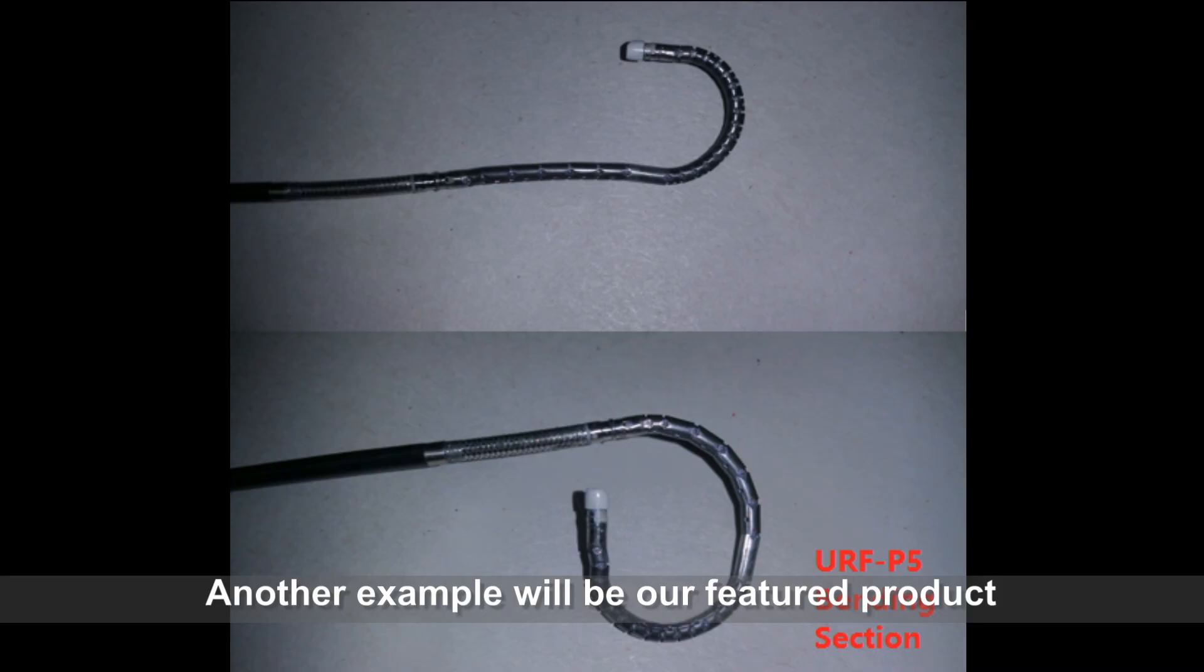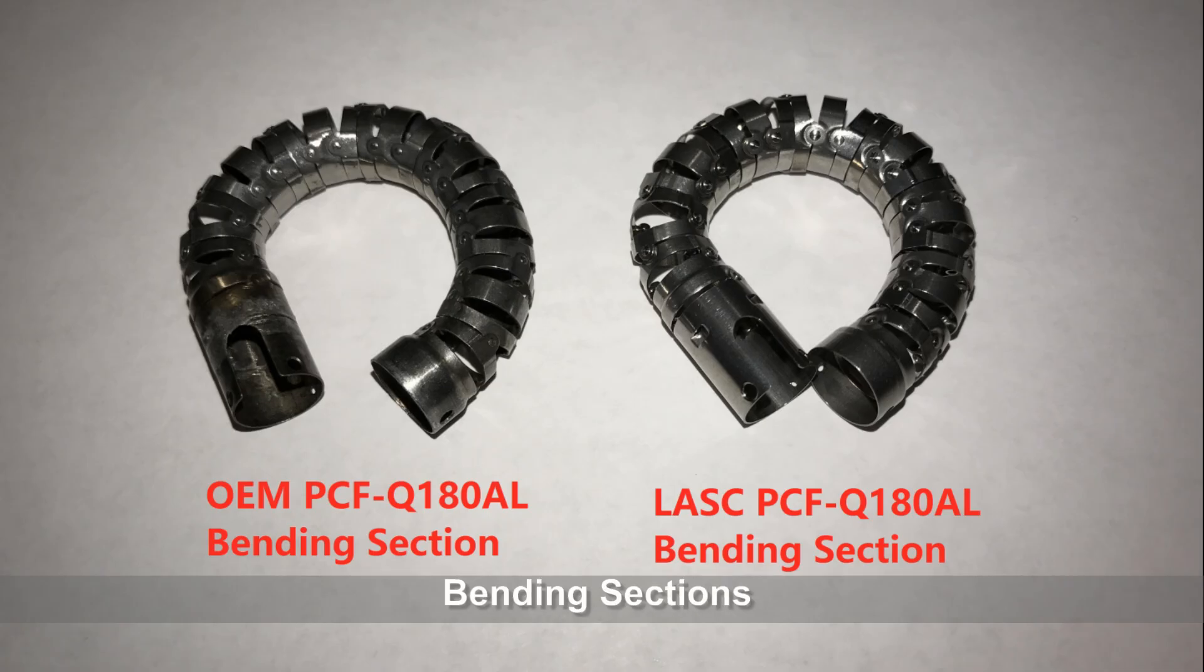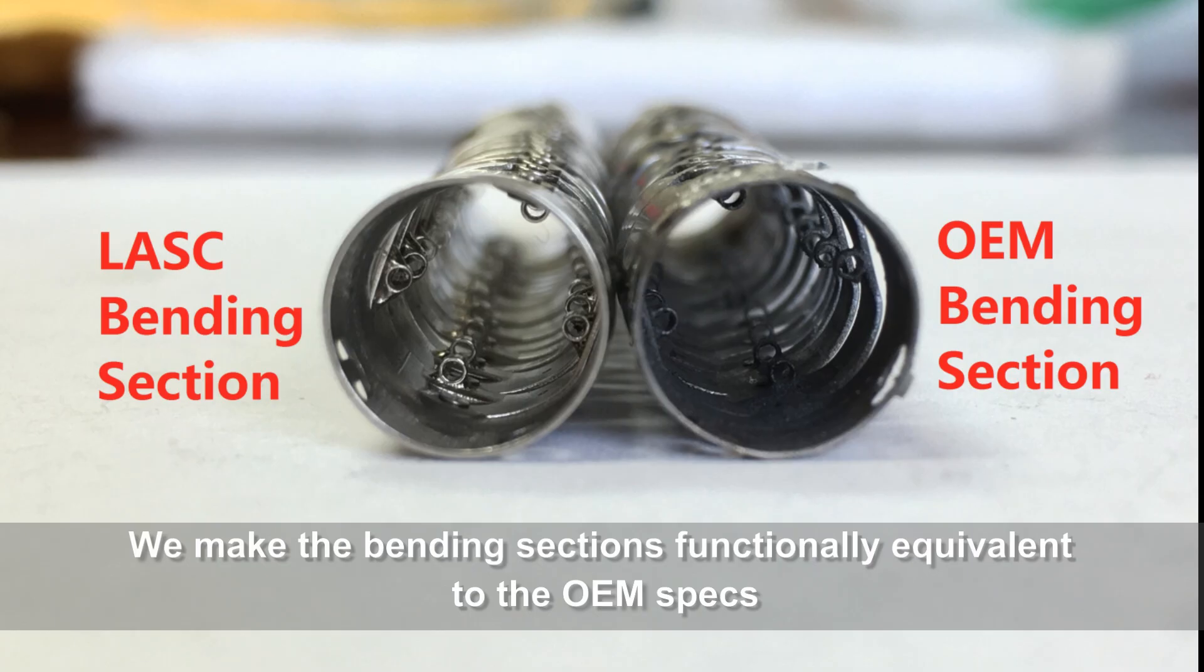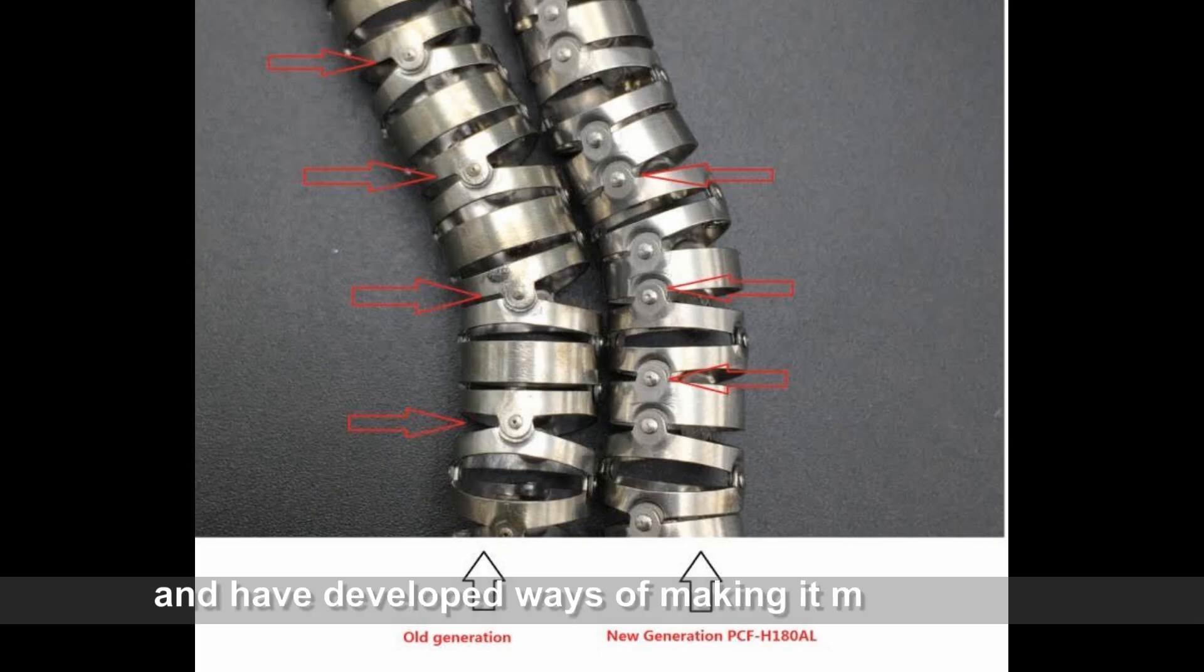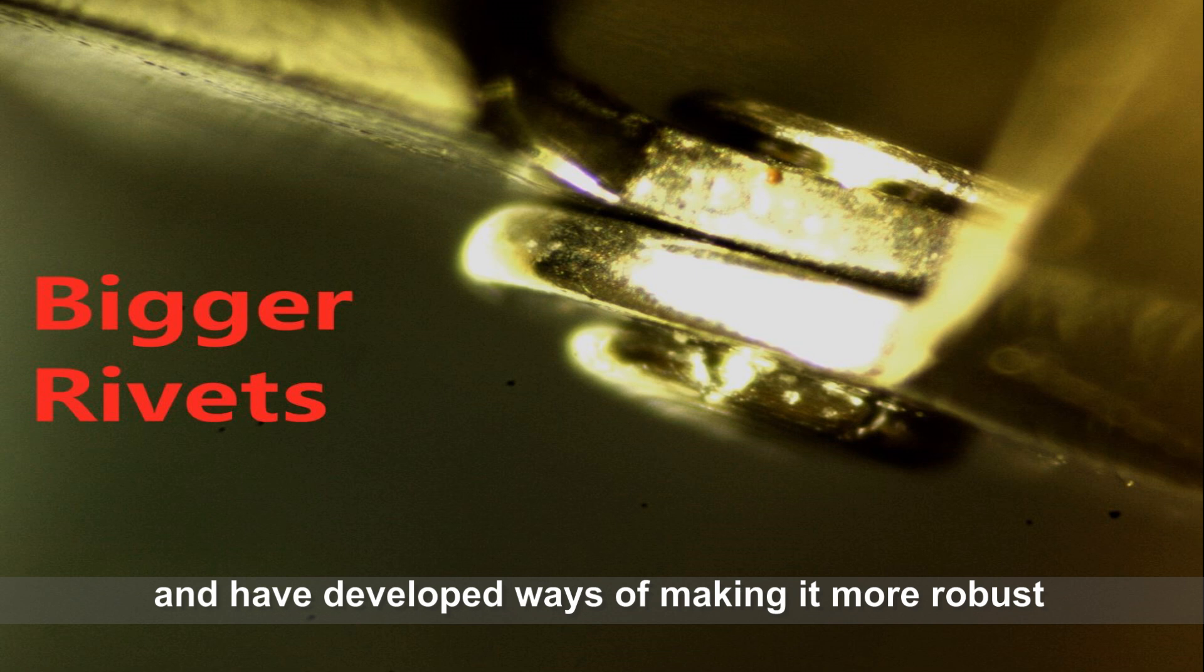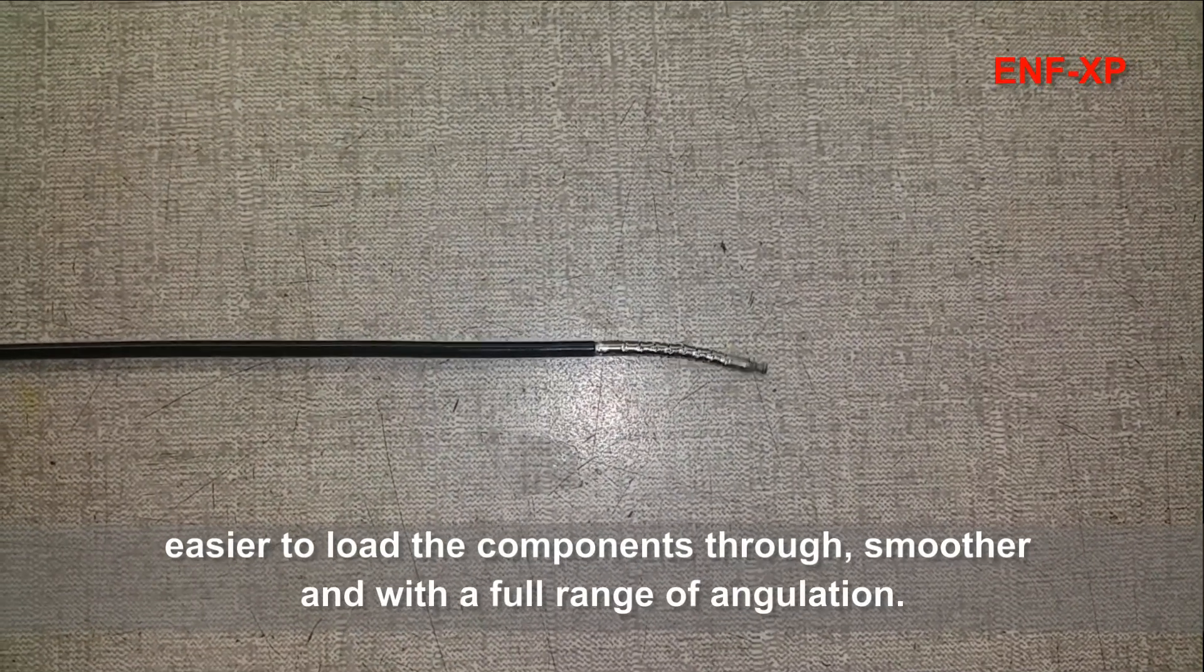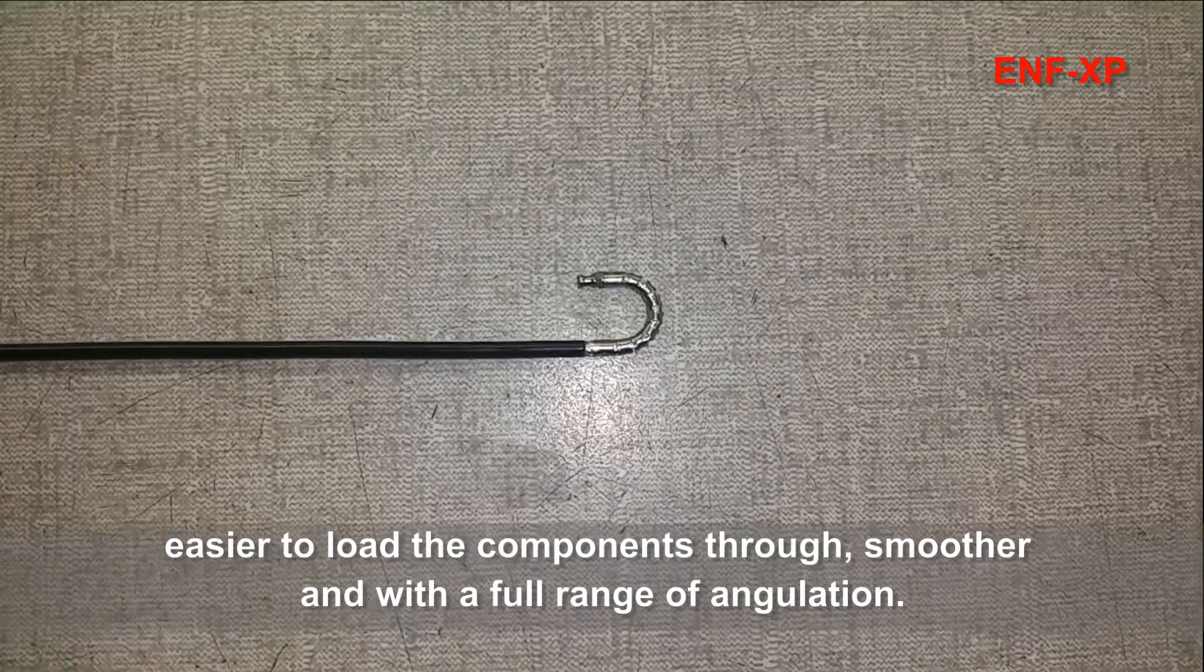Another example would be our featured product, bending sections. We made the bending sections functionally equivalent to the OEM specs and have developed ways of making them more robust. Easier to load the components through, smoother, and with a full range of angulation.